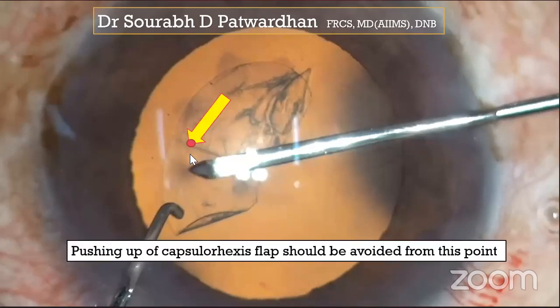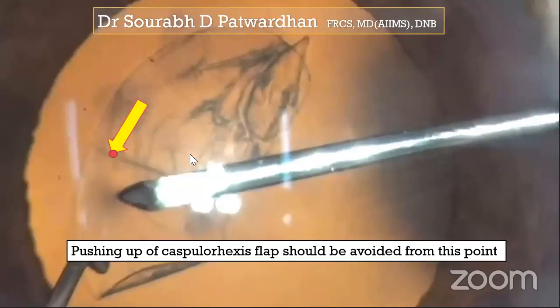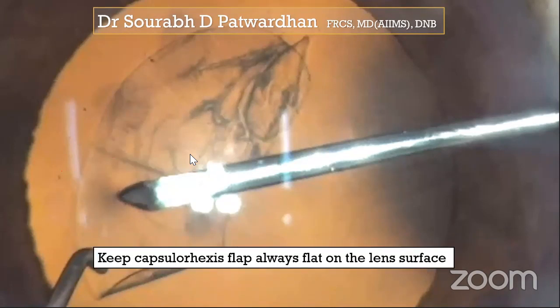Just a reminder again, I have already told you initially, if you push the capsulorhexis flap from underneath, just as you do at the start, it should be completely avoided because it may lead to an uncertain tear to the periphery. So that is one thing which you must understand. Pushing up the capsulorhexis from this point, which is commonly what trainees do, should be completely avoided. And always keep the capsulorhexis flap flat on the anterior lens surface.